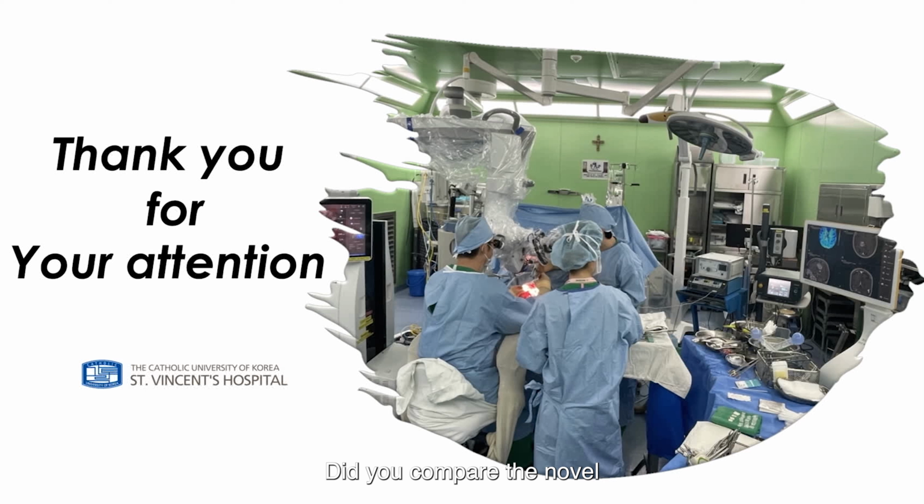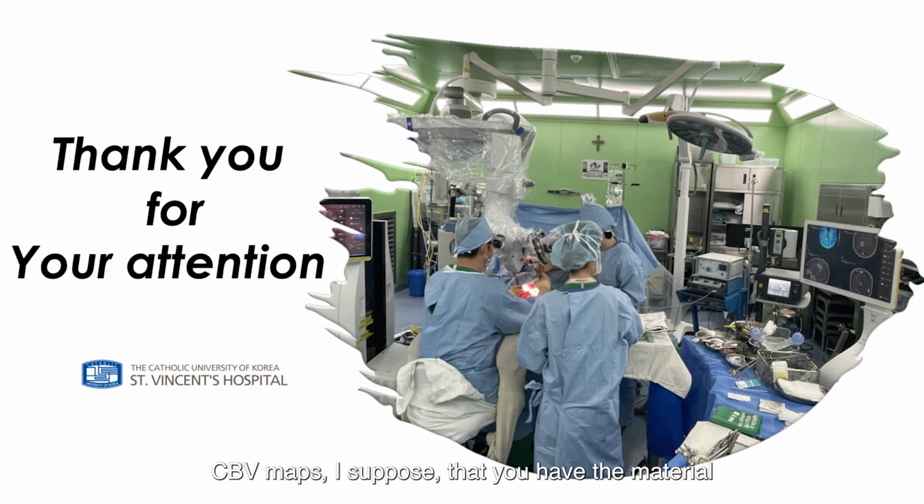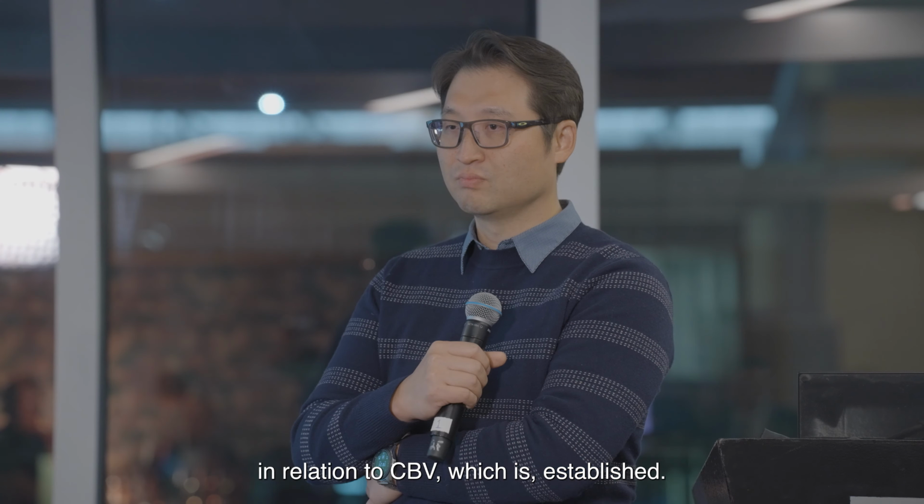Did you compare the novel perfusion maps with CBV? CBV has been the standard to identify viable tumor tissue for some time now. It will be interesting to compare the novel maps with the standard CBV map. I suppose that you have the material from the perfusion, so one could just look at whether the new maps give more information in relation to CBV, which is established.